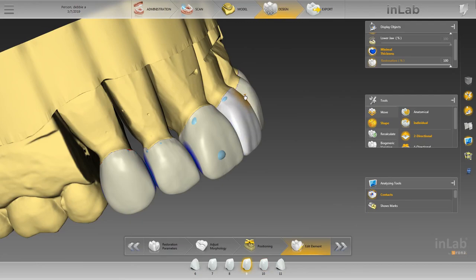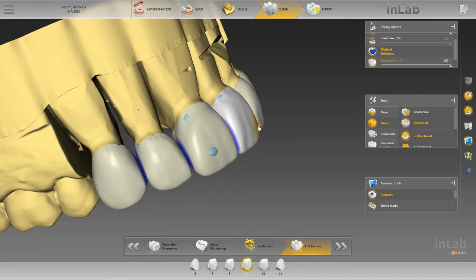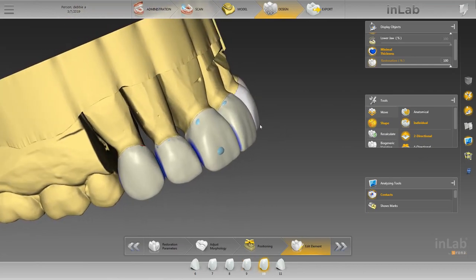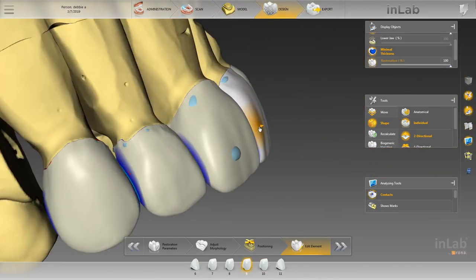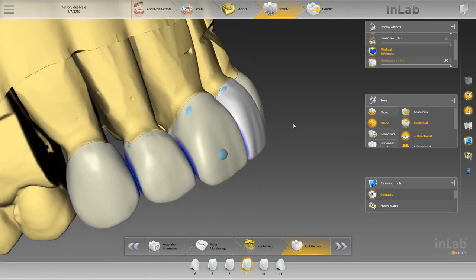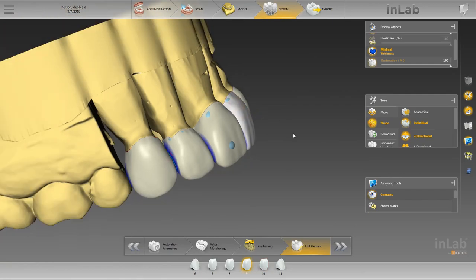So as you can see with my circular tool, I made the size of it about a third in length of the crown. Then bring that out, and then let that meet. Let the middle portion be like a bridge between the cervical or upper portion of the crown and the incisal portion of the crown. And then down here, bring it in slightly. That's just a good rule to follow. It usually ends up looking just straight up and down, and that's okay. And if you look at the contour line from this angle, this mesial contour line, you'll notice this lump down in the middle. You want to leave that straight. You want to leave it dainty. It's a great way to make the tooth look more natural.